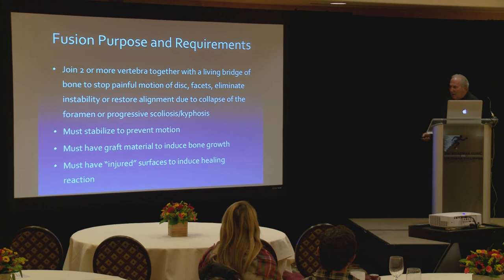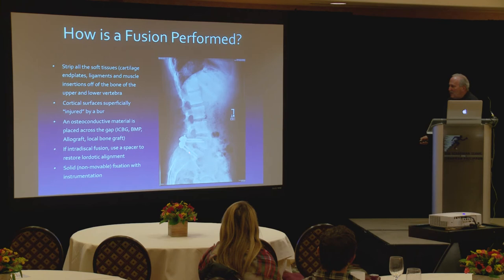So this is what a fusion looks like. It doesn't matter what instrumentation you use, but you have to immobilize the area. And in a TLIF, you can actually restore the disc height by putting a little plastic spacer, the most expensive plastic you'll ever see, by the way. But you need to buy stock in Medtronic for that. So this is what a TLIF looks like.